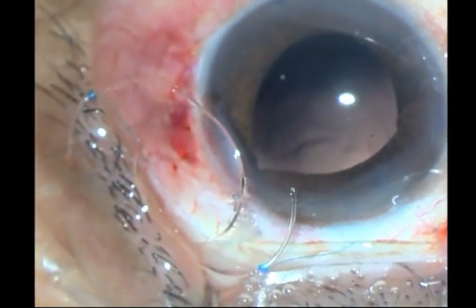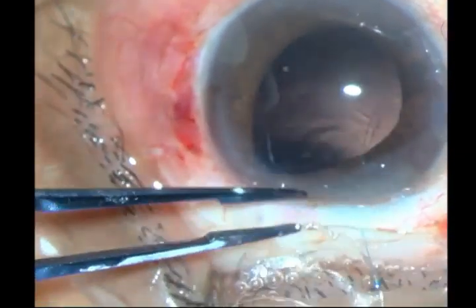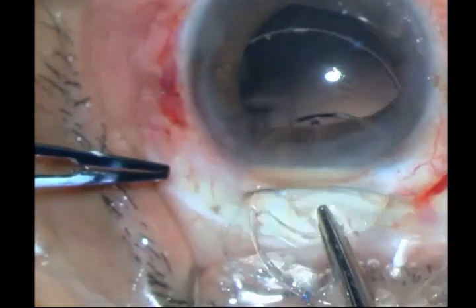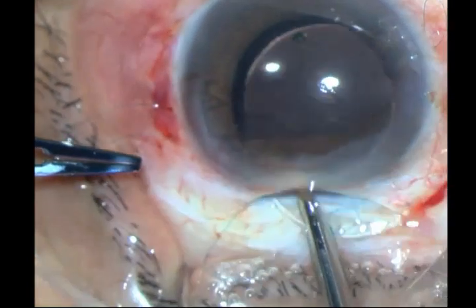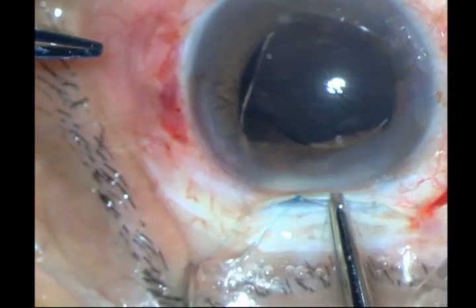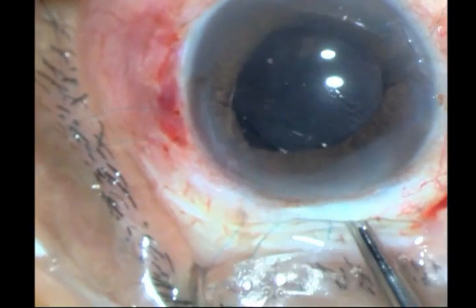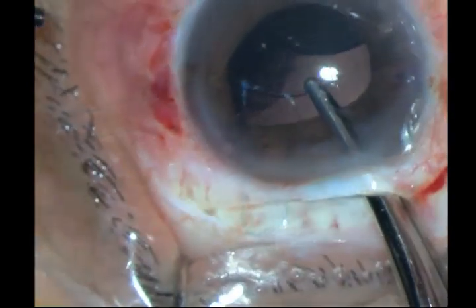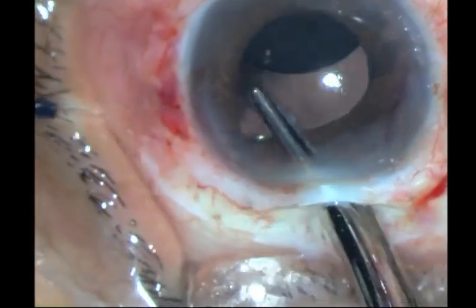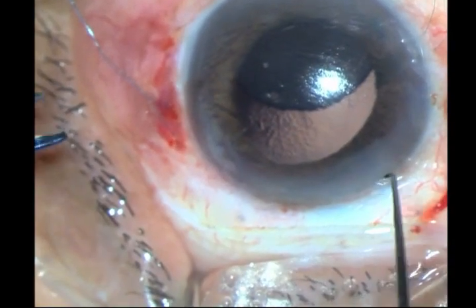Now to put in the IOL without entangling your sutures. Got one haptic in, trying to get the other haptic. It is a rigid lens. With a little tug I have been able to get that other haptic, and I am going to now pull it into place.